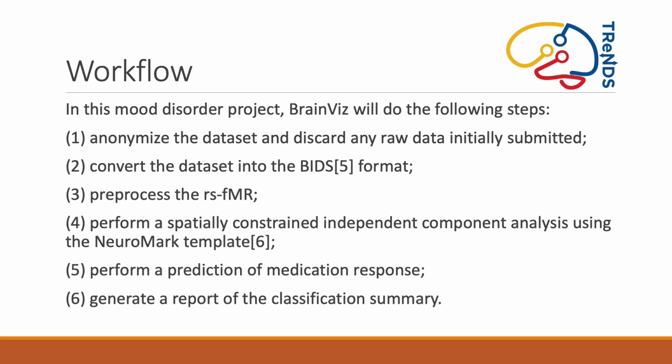In this reference project, BrainViz allows a user to do the following steps within a self-contained workflow. First, for subject data protection, the uploaded data set will be fully de-identified and original data will be discarded. Second, the data set will be converted into the BIDS format. BIDS is a community standard for neuroimaging research.